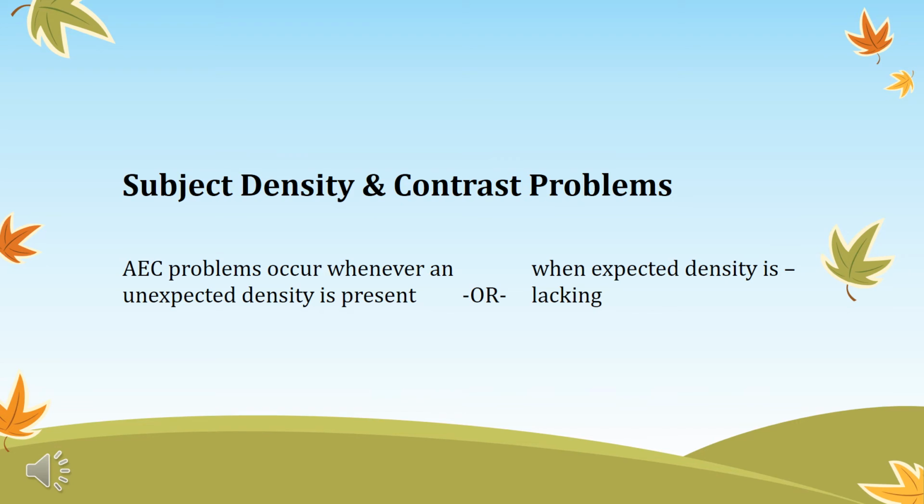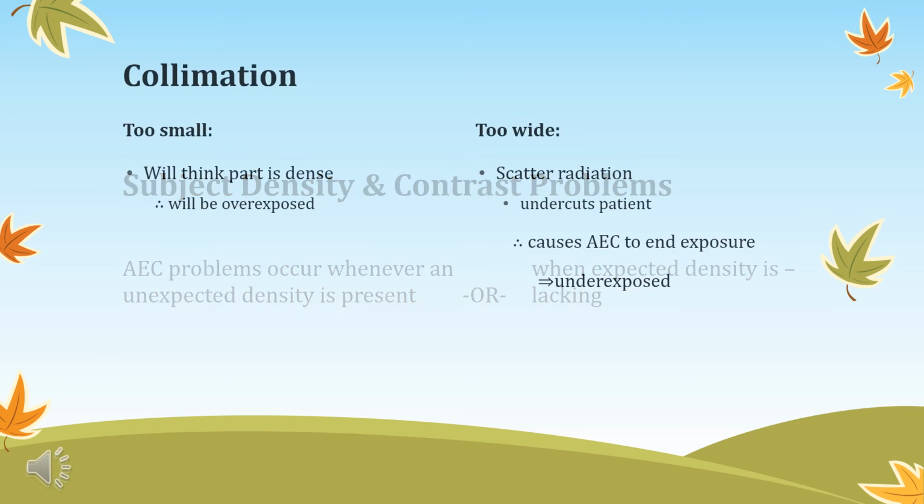AEC problems occur whenever an unexpected density is present, or when expected density is lacking. An example is that breast implants would be more dense.